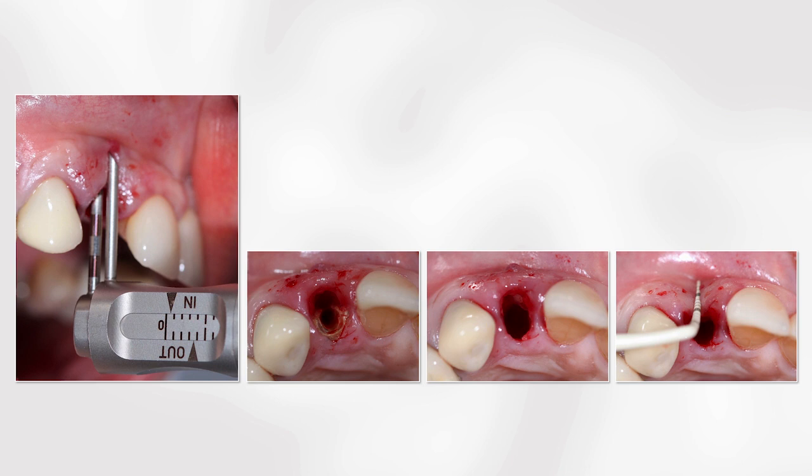Now it's time to decide if you intend to compensate with a soft tissue graft or not. Of course, when we use the IDR technique in a case like this, you don't need to add a connective tissue graft. We have the right indication for that. And we are going to discuss the use of the triple graft in the next module.